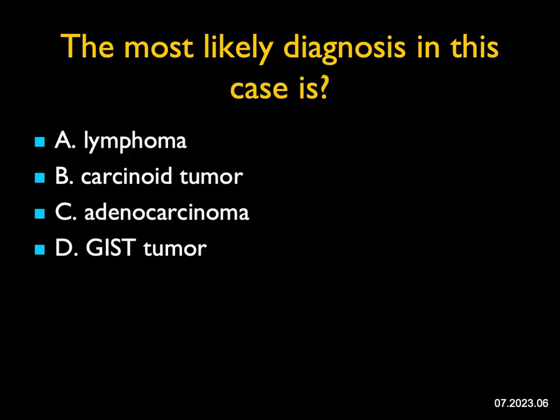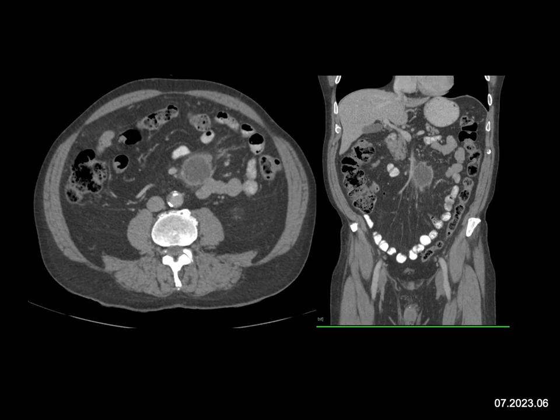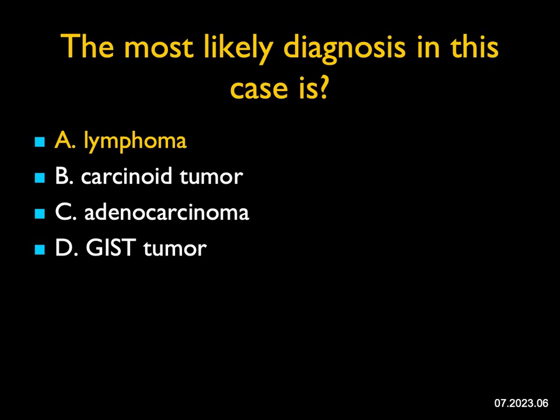The most likely diagnosis in this case — I see a mass in the mesentery adjacent to the SMA; it's somewhat cystic. Carcinoid tumors can occur in this region, though usually they're more distal, and they're vascular or solid. Adenocarcinoma tends to be infiltrating. GIST tumors are exophytic, arising out of small bowel. This is really adjacent to the bowel. When I see a mass adjacent to bowel and adjacent to vessels, I think of nodes — things like lymphoma or metastatic melanoma. I would consider carcinoid as well, except there's no desmoplastic reaction and none of the vascularity I'd expect. So the most likely diagnosis in this case was lymphoma.